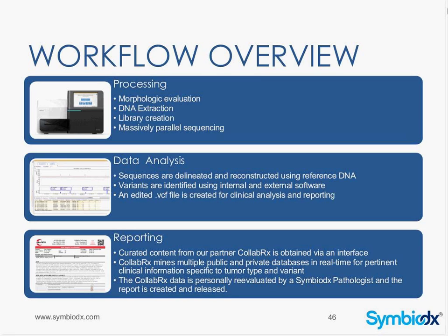We have the data analysis steps. This is when we actually have the data in the instrument. How do we arrange it and get it out? There is a program within the instrument that helps us identify the variants. We go back through and we can filter using many different parameters and using a couple of other different software programs. And then we can create an edited VCF file that would contain all of the variants that we thought were real and that were present at an acceptable percentage.